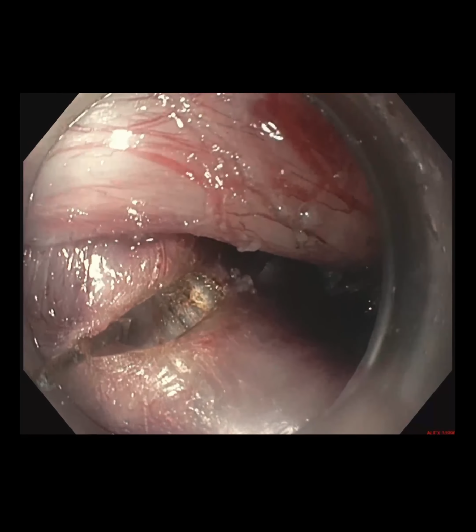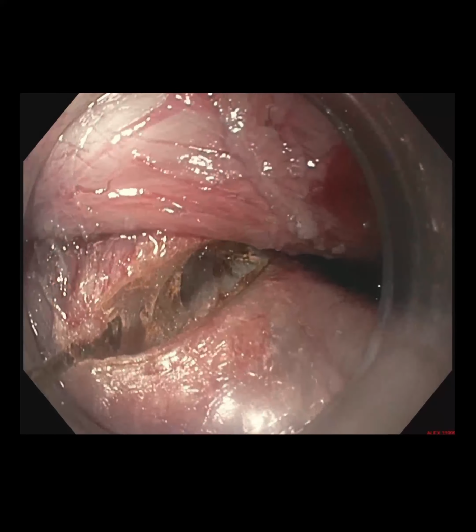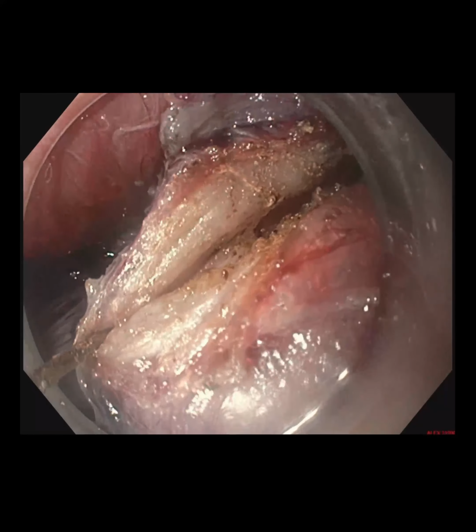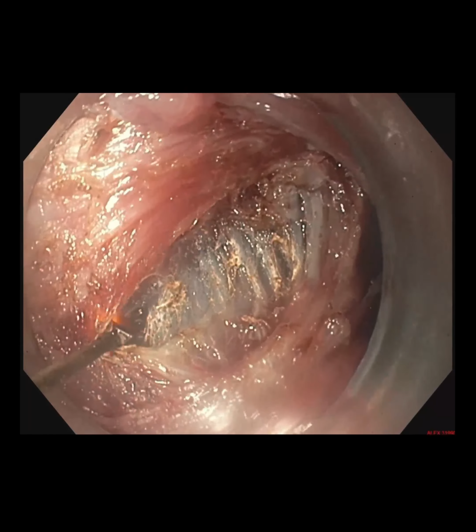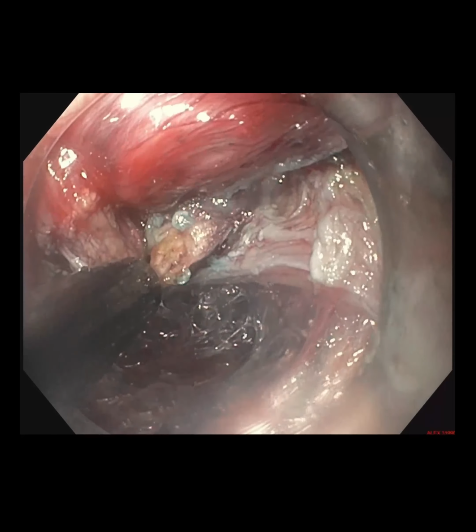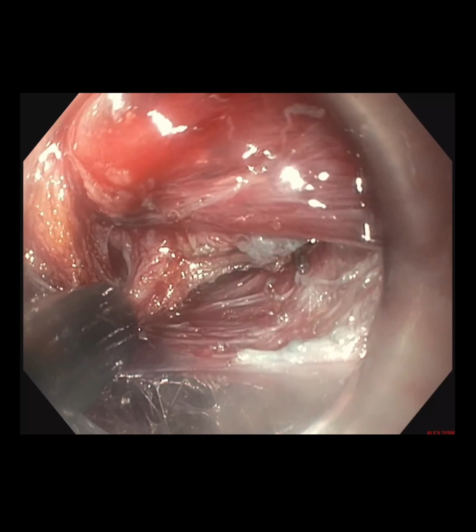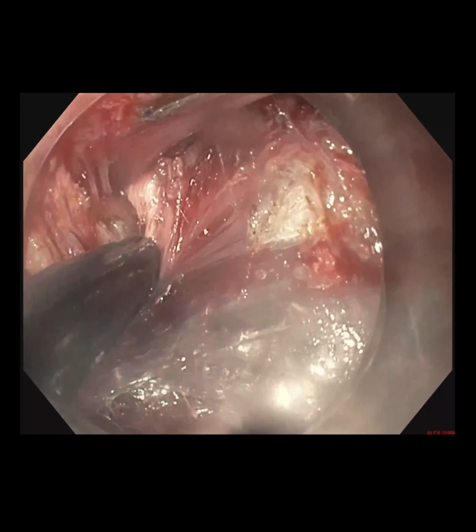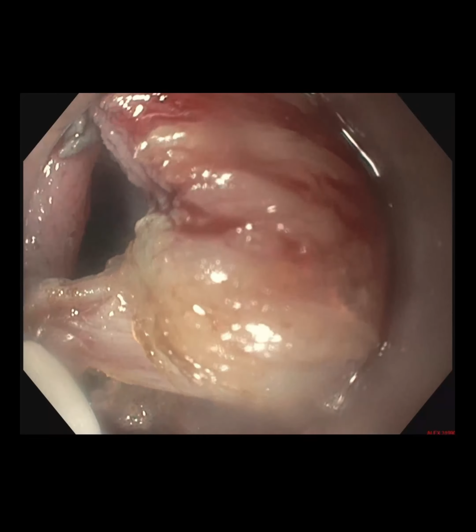Now the septum was carefully dissected gradually, keeping care of any collaterals because collaterals can be encountered in these thick septums. The myotomy of the septum was completed till the base. Now the lower esophageal sphincter myotomy was completed with the help of an IT knife so as to keep the mucosa safe and prevent it from any injury.